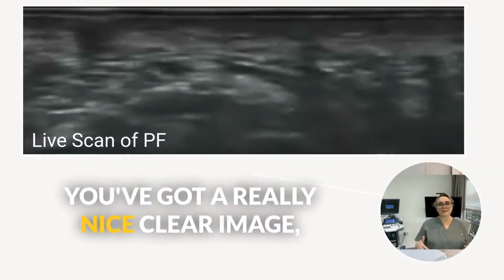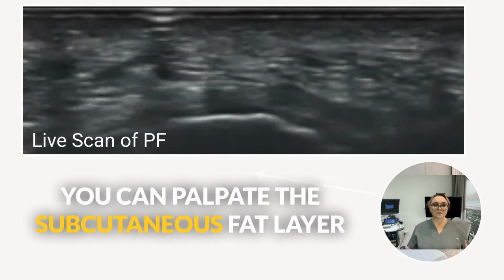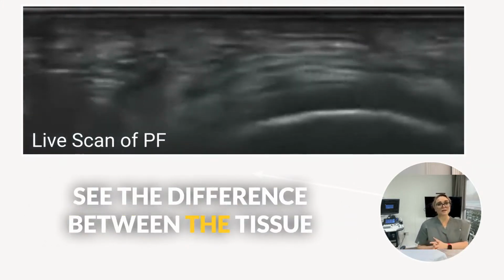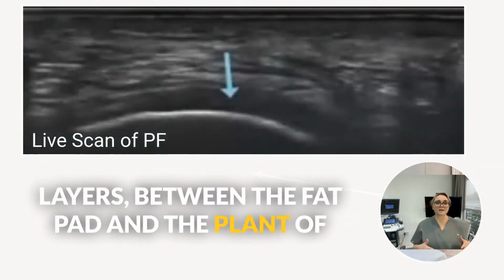Once you've got a really nice clear image, you can palpate the subcutaneous fat layer to try and create an interface to help you see the difference between the tissue layers, between the fat pad and the plantar fascia itself.